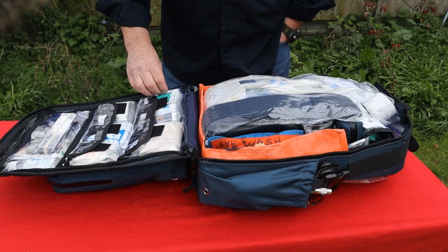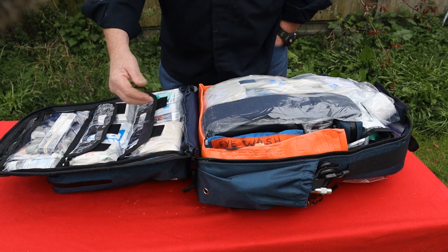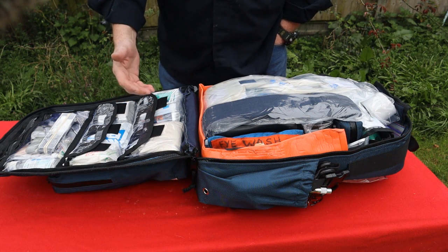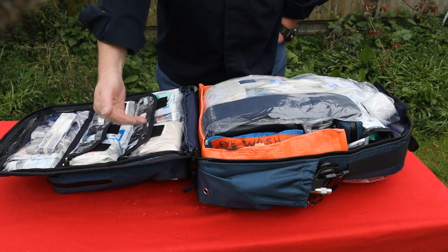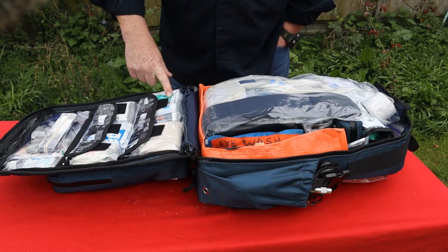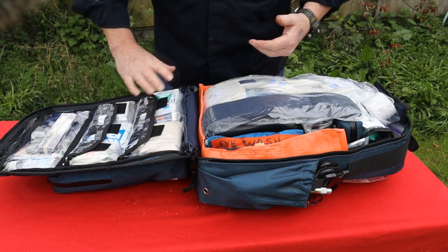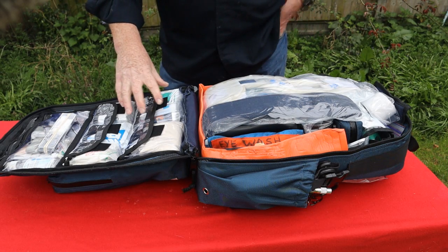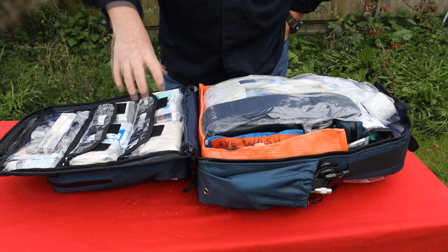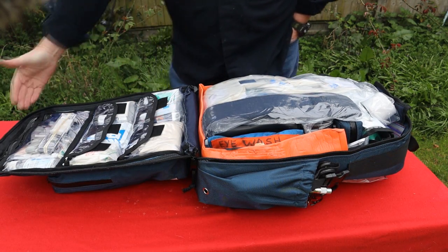Next one is ambulance dressing. So again, 3 sizes of ambulance dressing, and there's a 1, 2 and 3. A 3 would be a kind of 6x4, 6x6 pad, and they get slightly smaller. I've got antiseptic wipes, and all I would do is pull out a wipe, wipe the wound, put a dressing on it, cover it up. Again, mostly they're big dressings, they're sterile, they're in their packets still. So this is all basic life support.